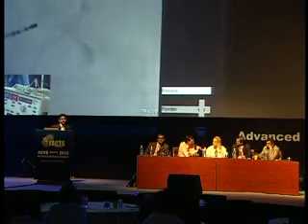So I have got a question to Dr. Ram as well as Dr. Narasimhan. Can you predict the outcome by any biochemical or other means? The question was, can we predict a response? Actually you can't predict at the time of the procedure, and the response is so variable, you just have to wait for the passage of time.